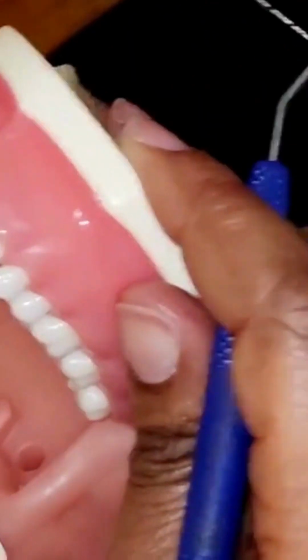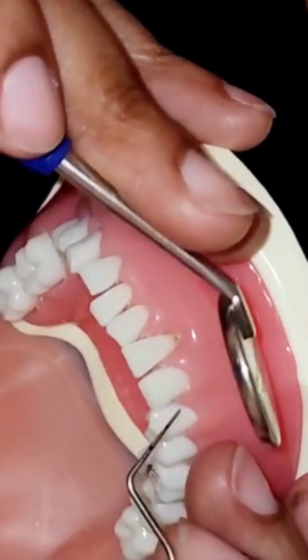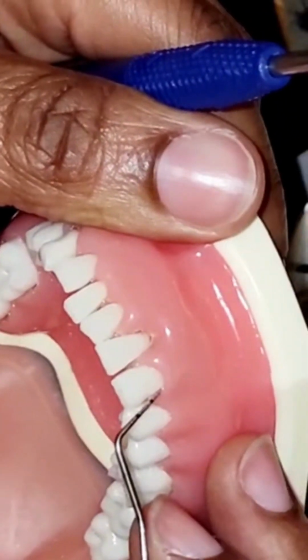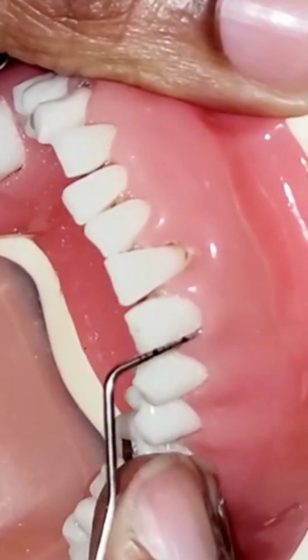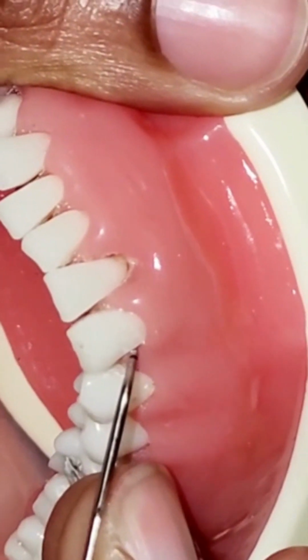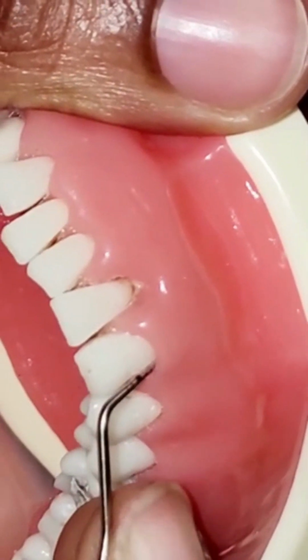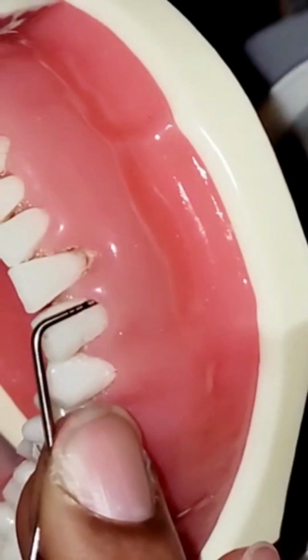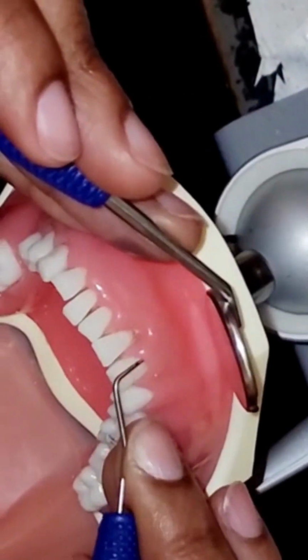Yeah, let's look at the whole. So technically I would have used my mirror to get a better view. I might not need that. Okay. We have a 4. Actually, I will need my mirror.